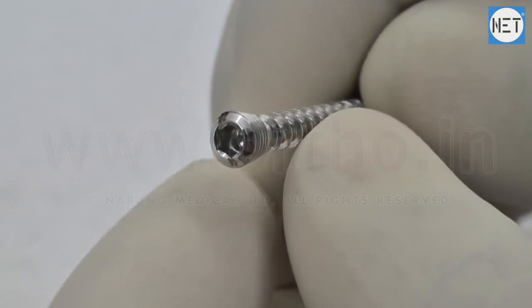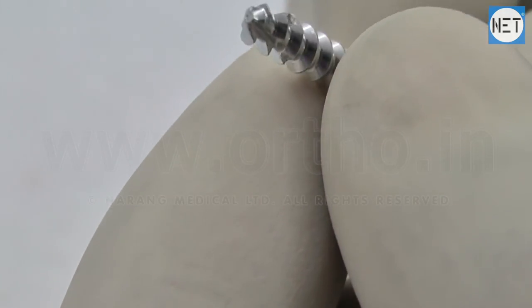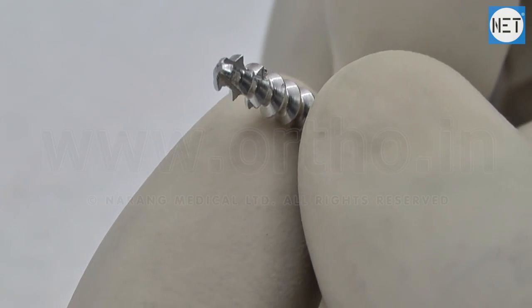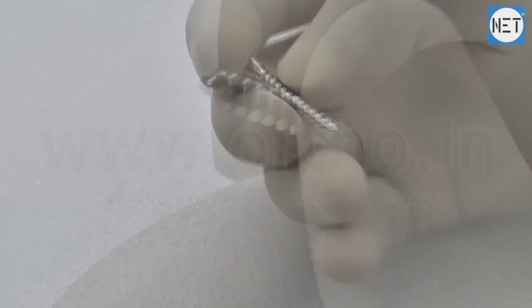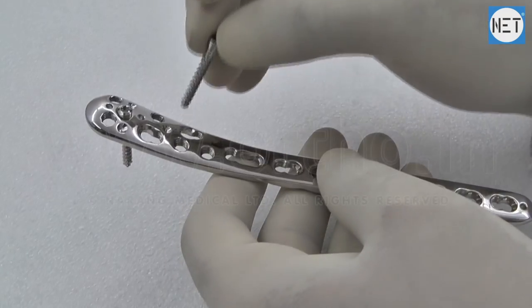Cancellous screws are widely used for fastening devices into metaphyseal and epiphyseal areas of bones. They have deeply cut and widely spaced threads to enhance the holding power in soft bones. These screws are used with small fragment safety locking plates.